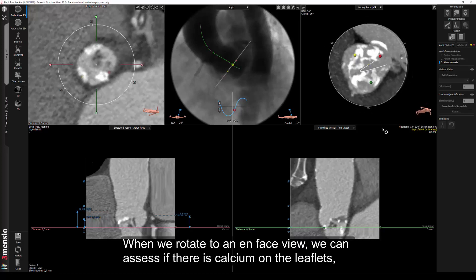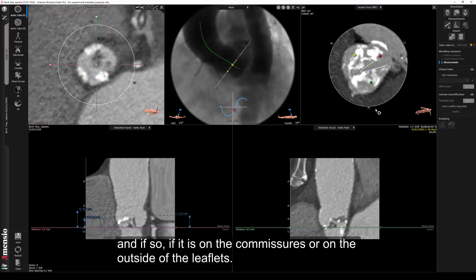When we rotate to an on-face view, we can assess if there is calcium on the leaflets, and if so, if it is on the commissures or on the outside of the leaflets.